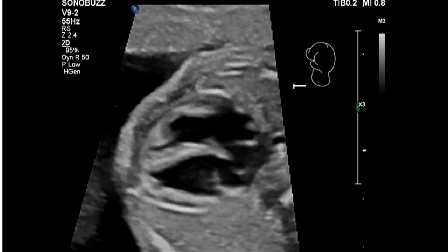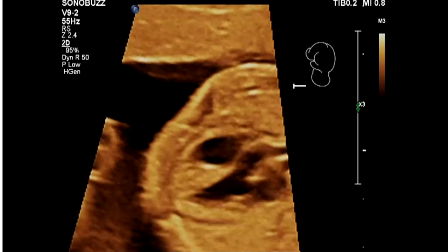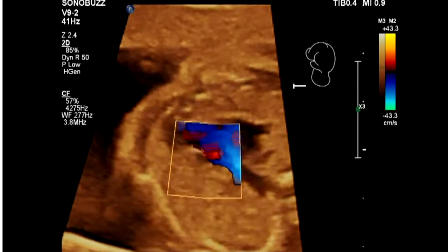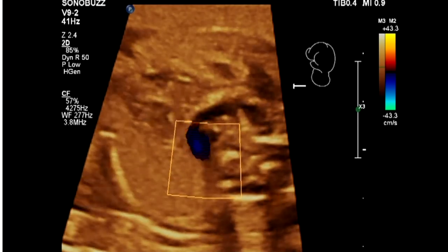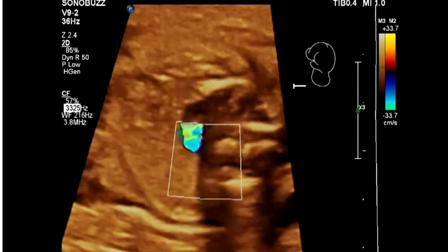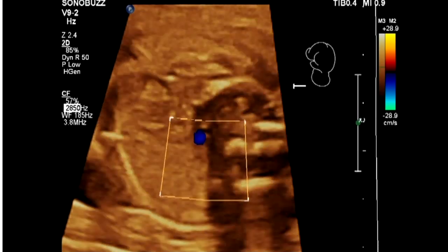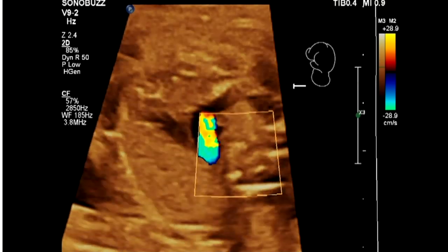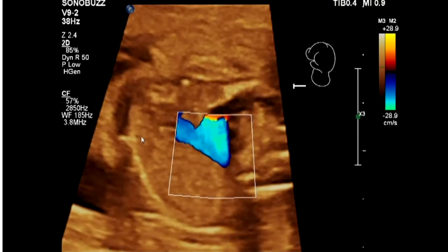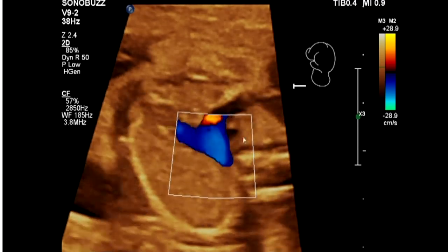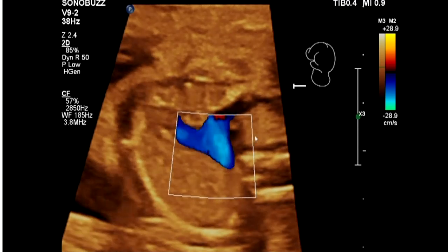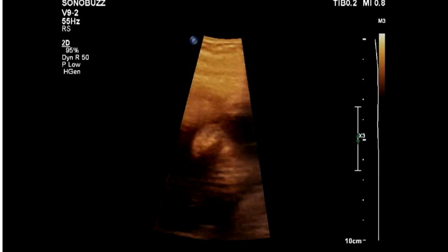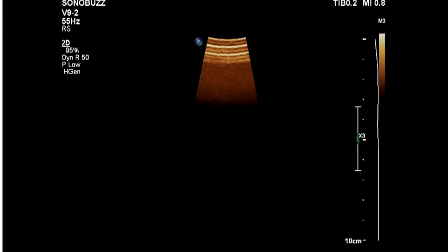This is a nice normal heart. I've been using two hands almost the entire time — without that it would be much harder, particularly with an anterior placenta and the baby not in the best position. We showed there's no VSD and no significant valve regurgitation. On the three-vessel view I usually lower the scale to make sure I'm not seeing an aberrant right subclavian artery — it would come just about here heading towards the right behind the trachea. I always like to look that I'm not seeing that by lowering the scale all the way down.